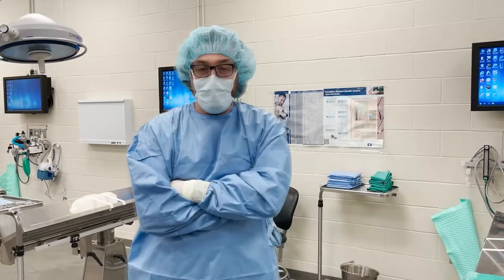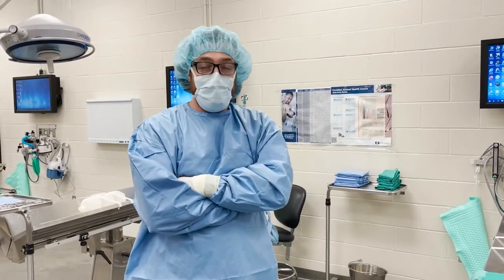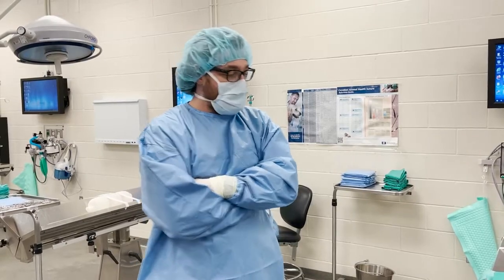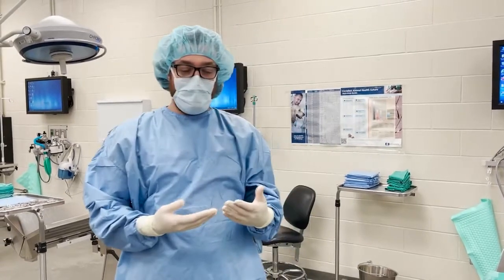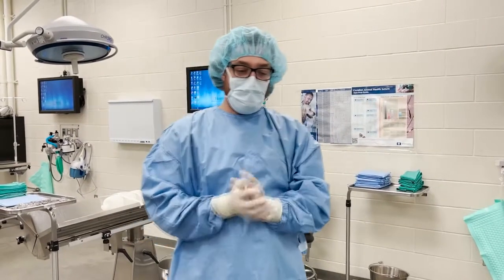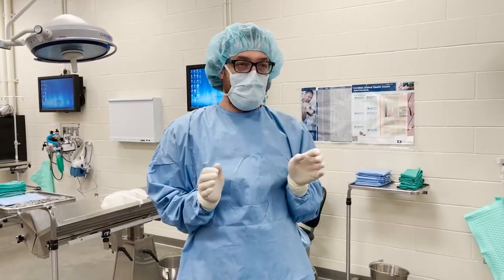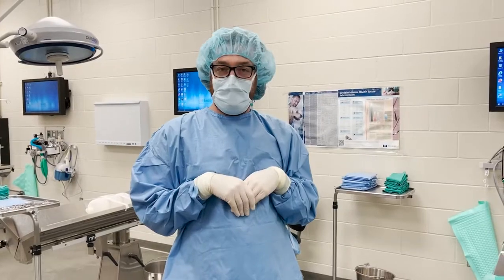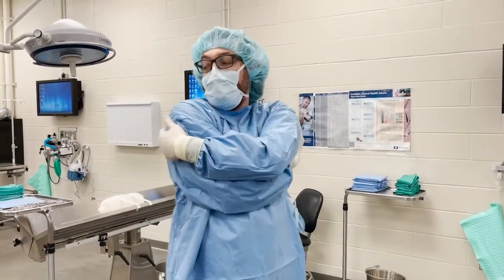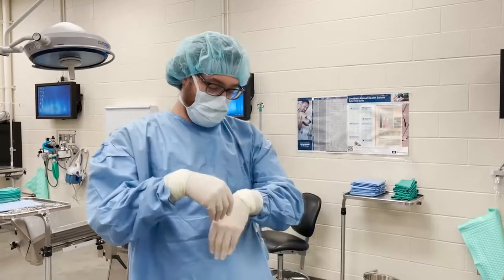Now that you're sterile and getting ready to drape your patient, this is when you're most likely to break sterile field. Once you're sterile, you want to keep your hands below your chin and above your waist. It's fine to have them like this — you can be a little praying mantis or like a ferret — and you can do a short cross. You don't do a big arm hug; you don't want to touch your back or your sides.